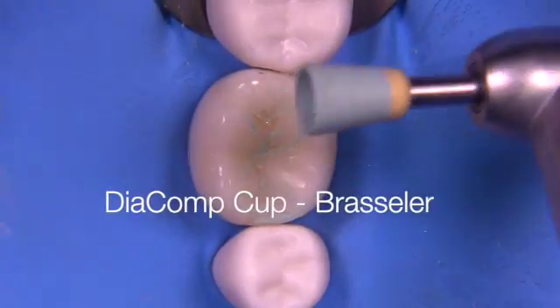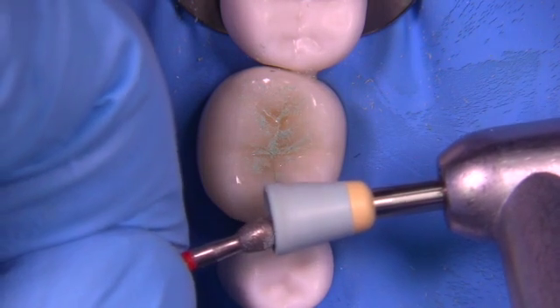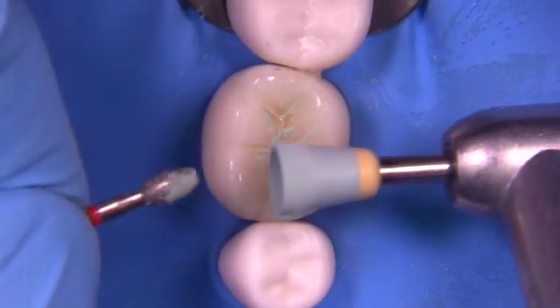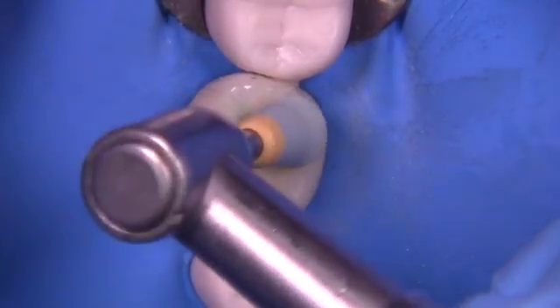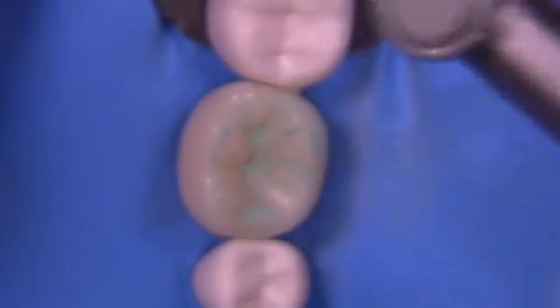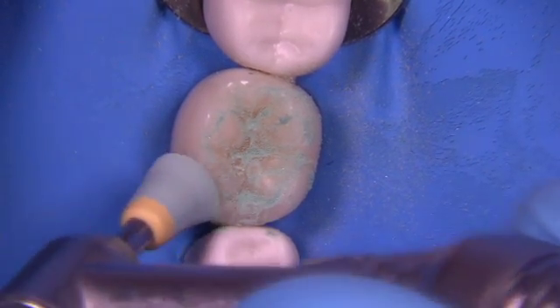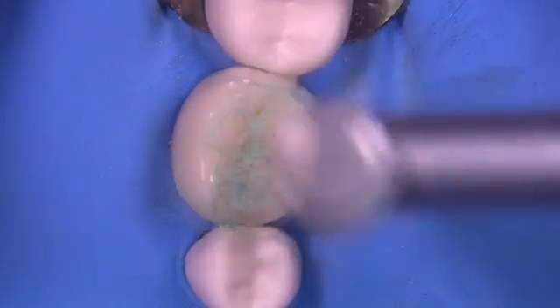Now we're going to switch to the Diacomp cup, which in this case is a little bit blunted, so I'm going to spin this up against an egg-shaped diamond — like spinning clay on a potter's wheel — changing the shape of the lip to make it a little bit more pointed or sharp so it can gain access into the groove areas and become more flexible as well. We're going to utilize the edge of the cup. Some people look at these cups and wonder how they could possibly be used to polish grooves, but it's incredibly effective in getting into grooves and convex surfaces. These cups are also great because they're very flexible when thin and they gain access to the interproximal zones, creating a really nice smooth transition into the embrasure area. Keep this cup thin at the working side.